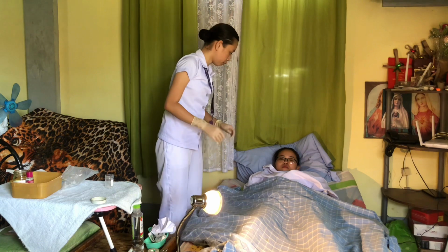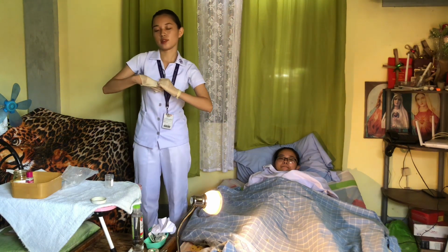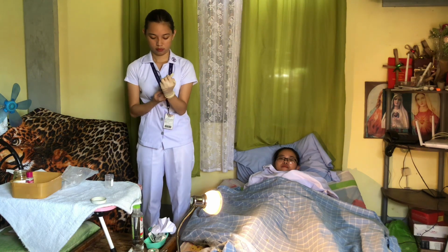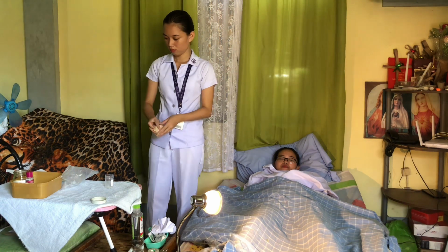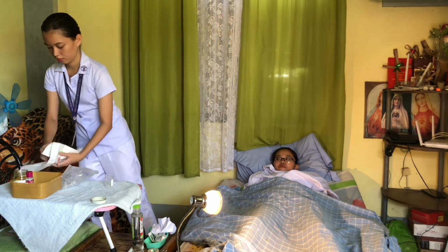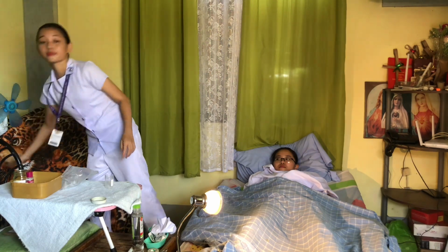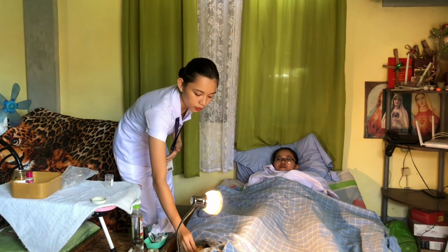How do you feel? So now I'm going to discard my gloves. After doing this procedure, I have to turn off the light.